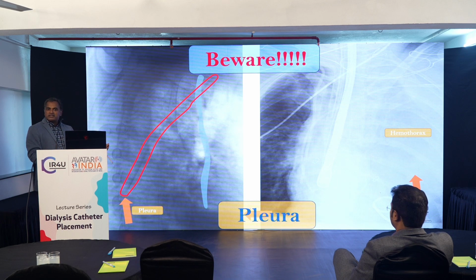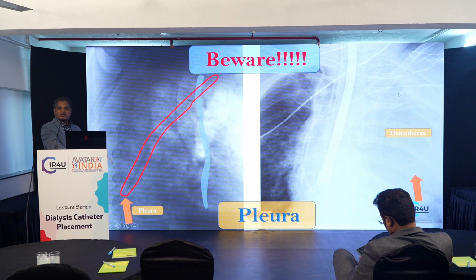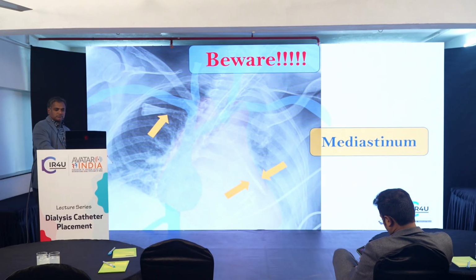So blood is not aspirated, the catheter is not in the right place, so you should be aware, okay, this is somewhere else. On the left side, one picture you see was placed by an anesthesiologist during an intra-procedural as a subclavian catheter. This is where we always say beware of subclavian complications. It resulted in a hemo and pneumothorax, and they were not aware until the end of the procedure, so we had to go in and put a chest tube in this patient.